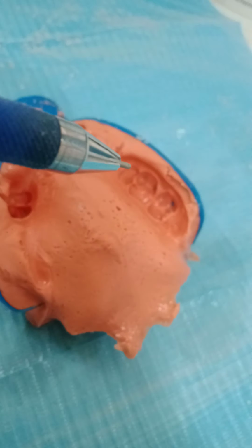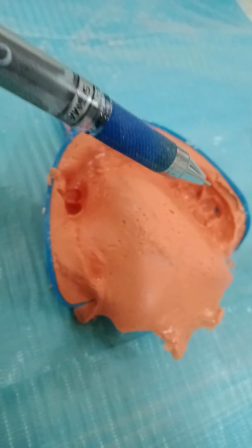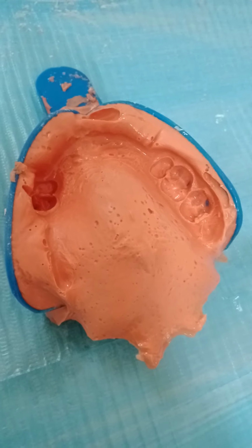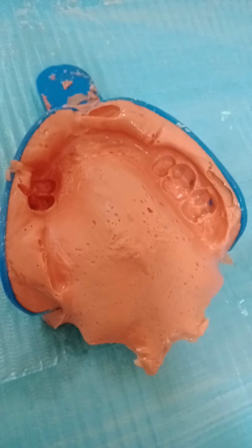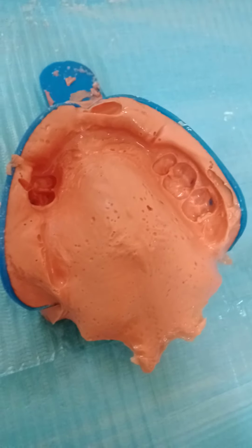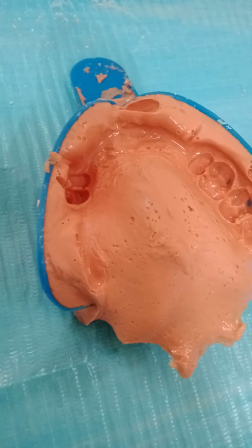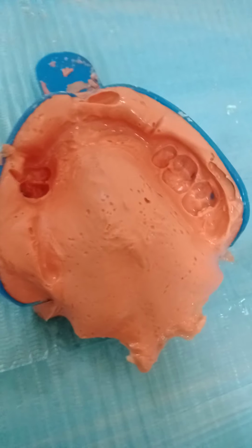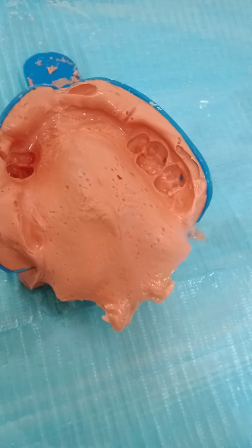The occlusal surface of the teeth are okay. Do you see that the tray is showing through buccal surfaces? What does this mean? There's deficiency in material. Deficiency? No. This is the tray is small. Yeah, but I don't have lateral space beyond the teeth. Yeah, the largest tray. But this is our largest tray. All of these recommend that we do a secondary tray.